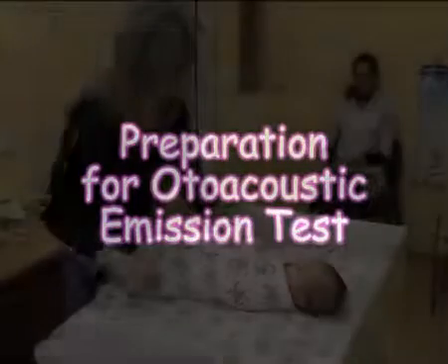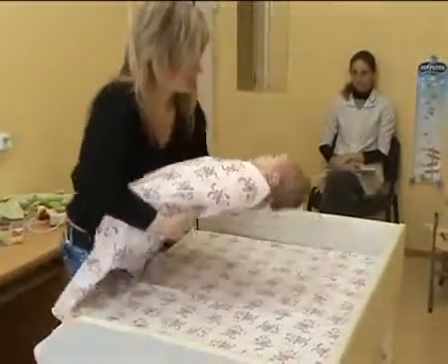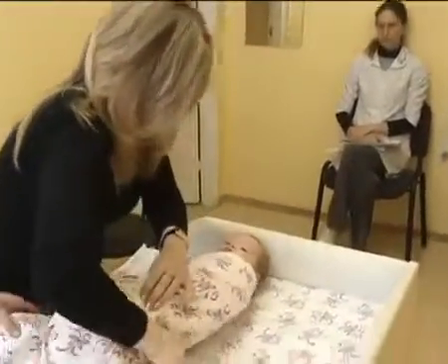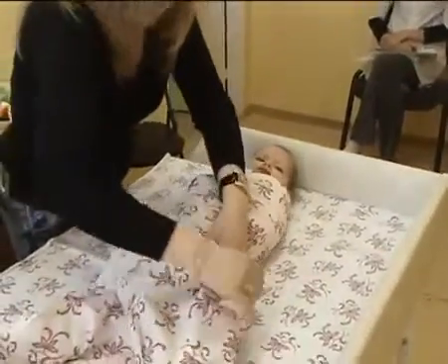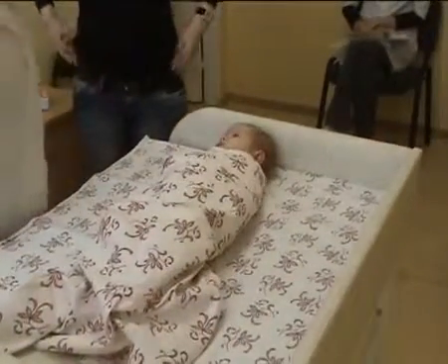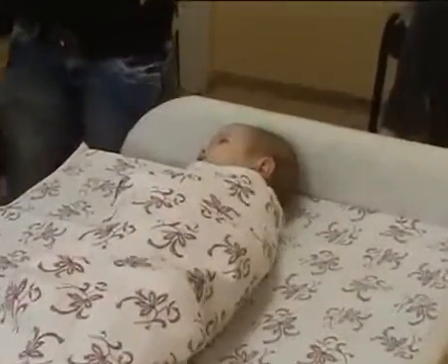Preparation for otoacoustic emission test. Prepare a newborn for the test. Otoacoustic emission test and auditory brainstem response test are better to be performed on a sleeping newborn older than 24 hours. The most suitable time for the test is an hour after the feeding and nappy change.